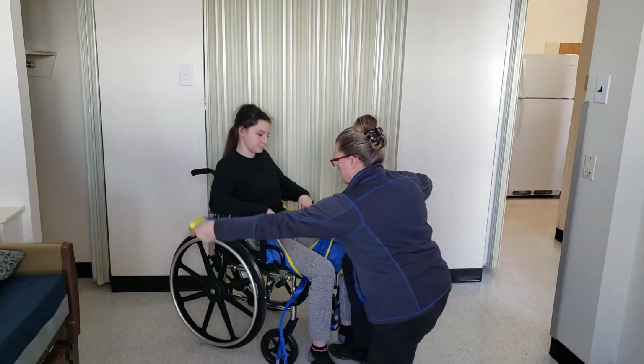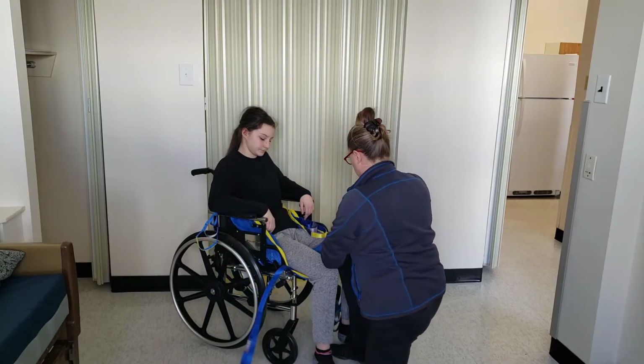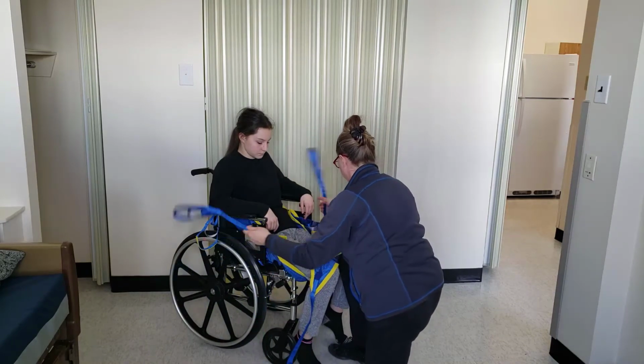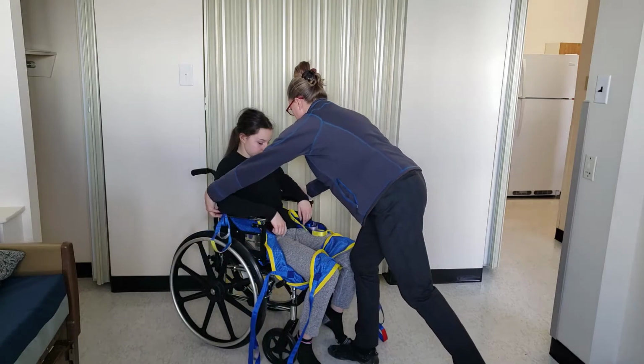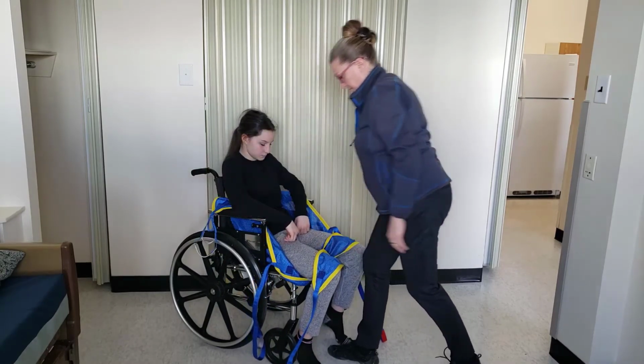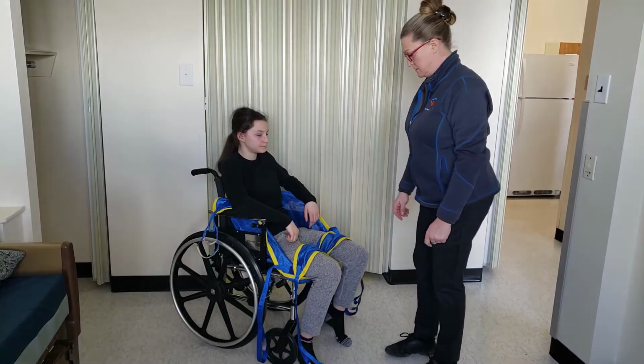Once that is underneath them, you're going to cross over the leg straps. Make sure that everything is hooked up right. Now we're ready to go onto the Hoyer lift.